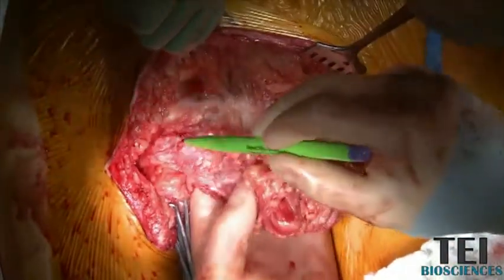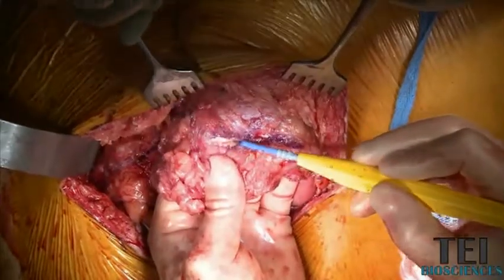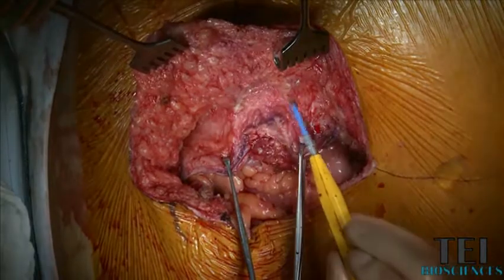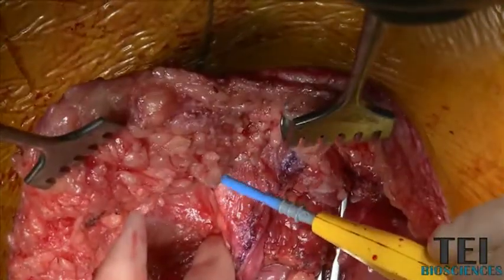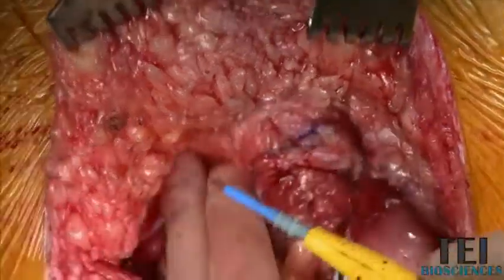Here's the sac. I need to come back behind that in order to get decent fascia. You've heard of perforator-sparing techniques — there's a good perforator right here that I can see. I'm preserving that blood supply to this skin edge, and that should be enough.